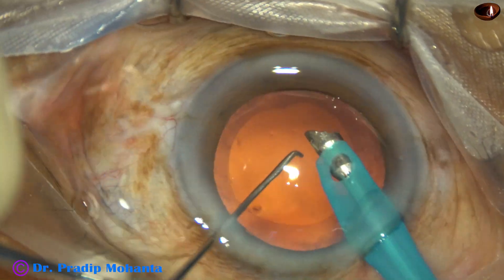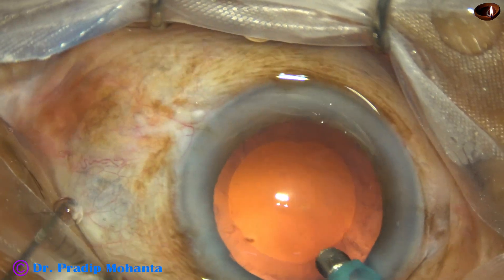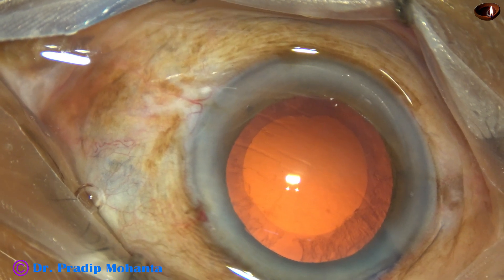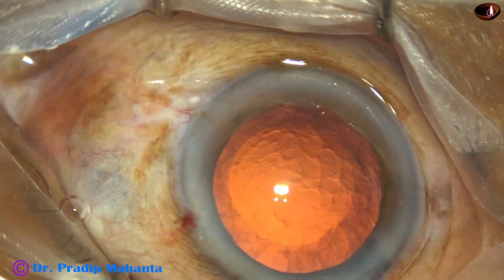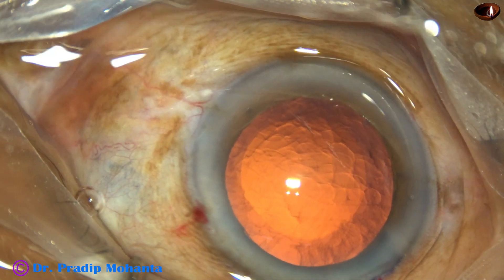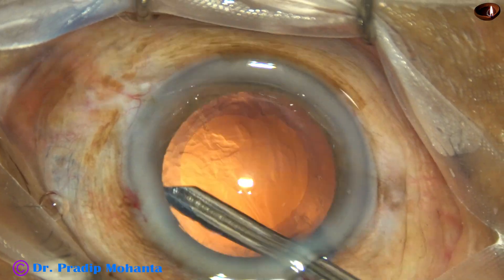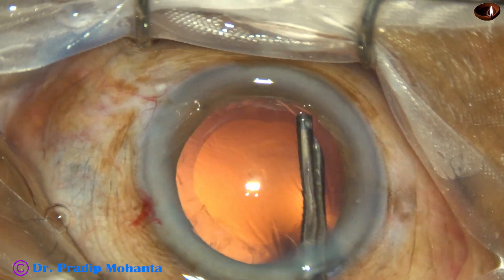And nowadays I am making a habit of cleaning a lot of cortex with the phaco handpiece itself, and leaving very little for the Simcoe cannula. There is some cortex all around underneath the anterior capsular rim, and I am going to remove that with the Simcoe.